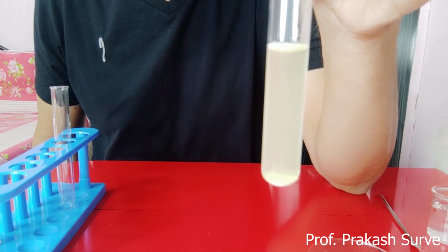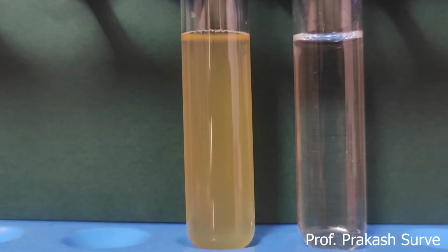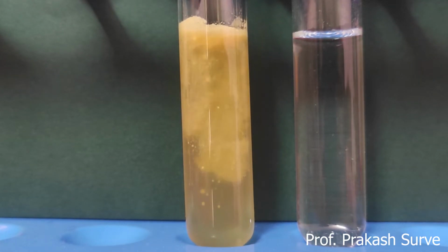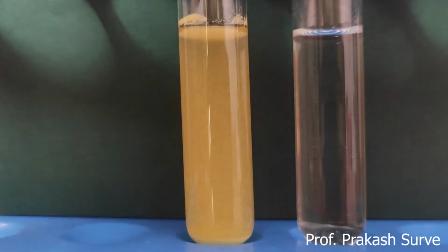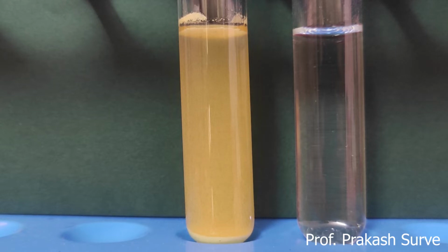The sulfur powder sinks rapidly to the bottom in this urine sample. This is because of what? The bile salts present in this urine sample reduce the surface tension of the urine so that the sulfur powder sinks down. And this condition we don't find in the case of normal water or the normal urine sample. So this is about the sample of urine which is abnormal.